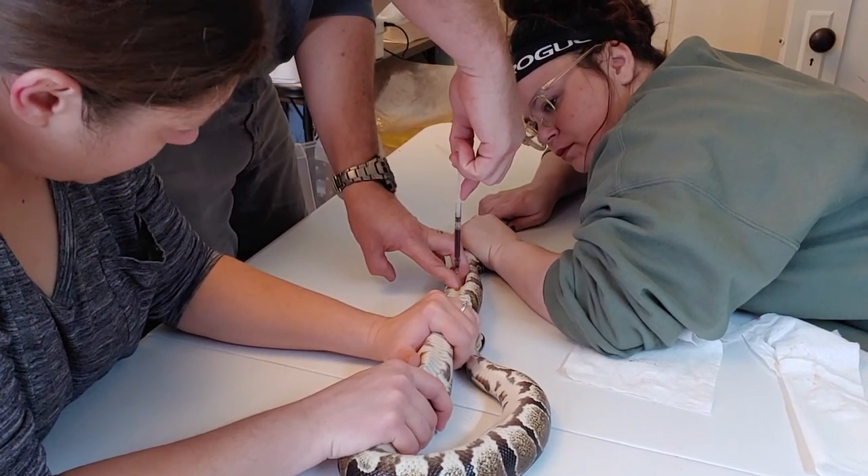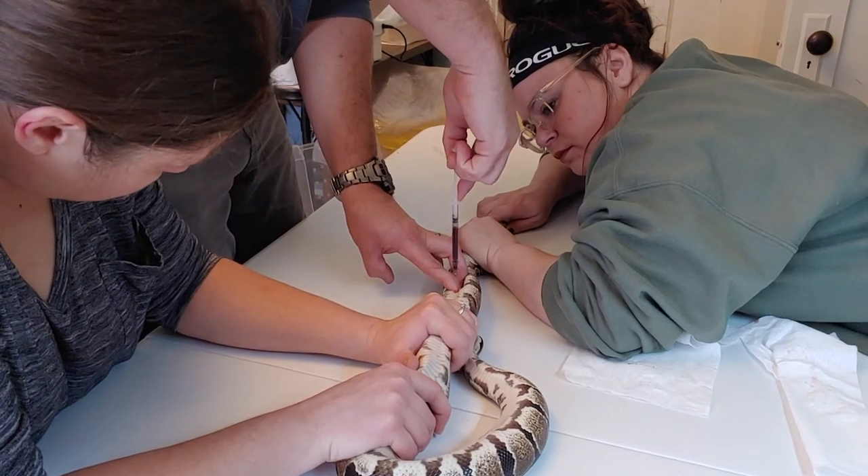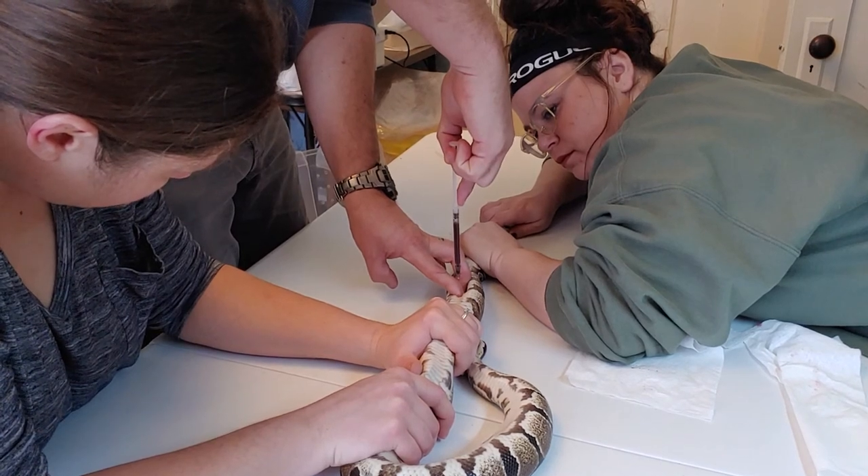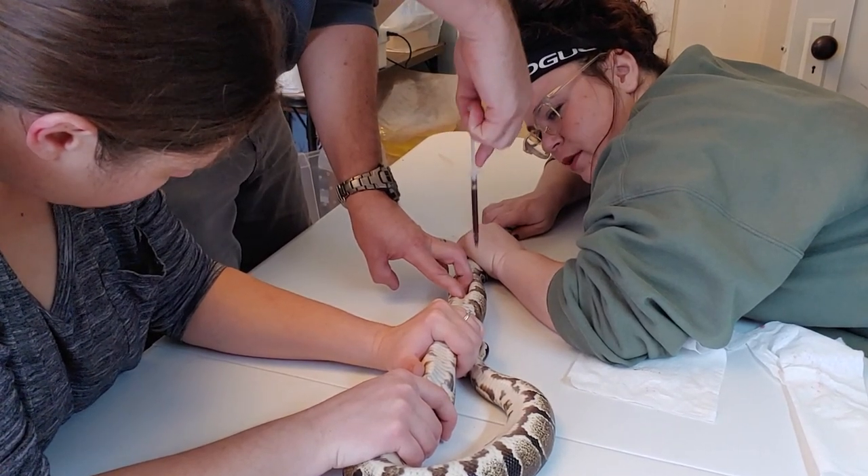And then you just pull it out as soon as it's safe. Okay, here we go. That's nice dark healthy blood. Keep holding.